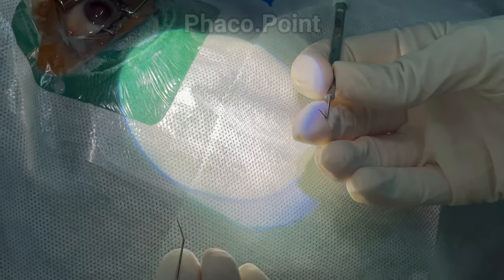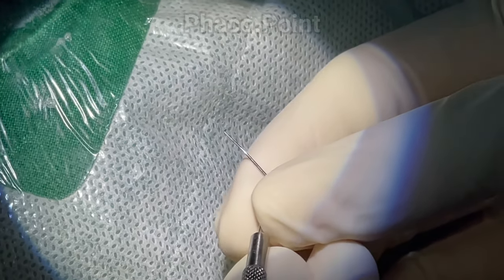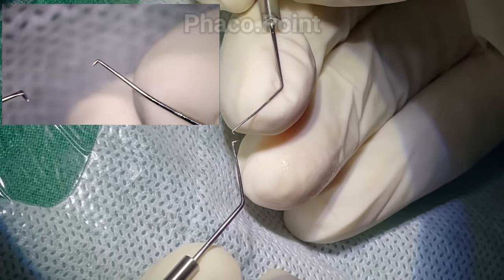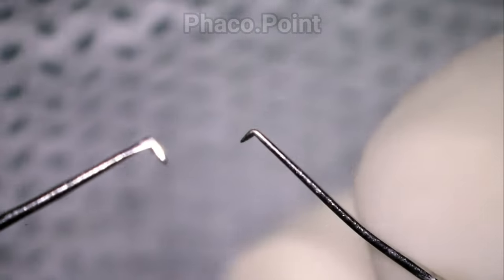Point six: make sure your second instrument — whether a Sinskey hook or a chopper — is the correct one for the case. In a very hard cataract, you may need a longer chopper rather than a short one. The choice of second instrument should be made at this stage, since you have already assessed the nucleus density preoperatively and know the disassembly technique you will be using.